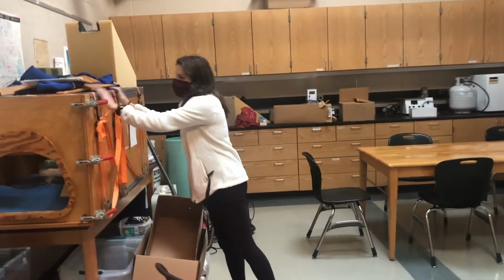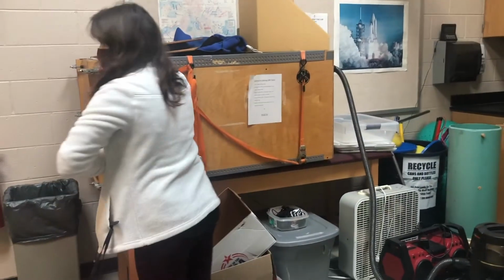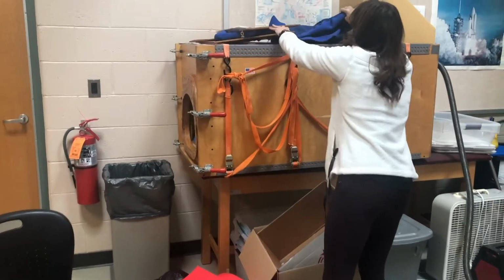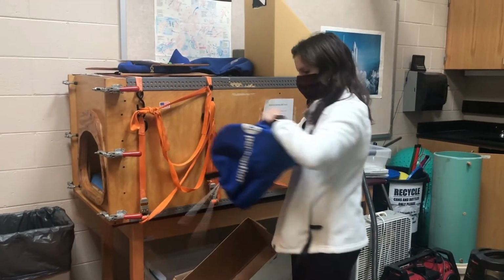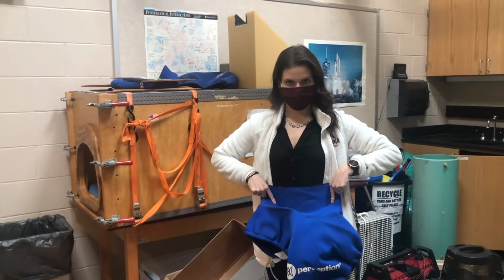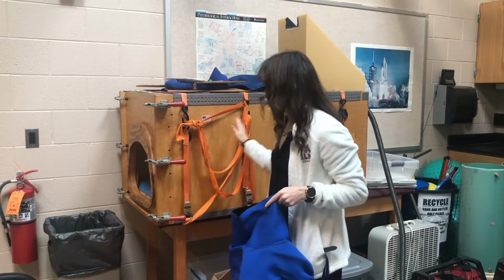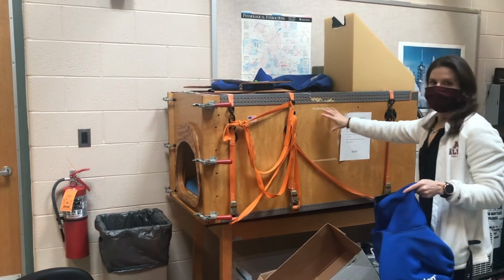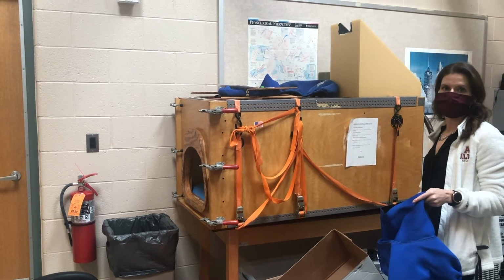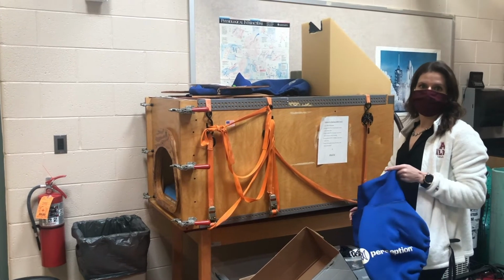And then this last piece of equipment in the cardiovascular lab is what we call the lower body negative pressure box. We can have someone actually get in here to where their torso from kind of mid-torso down is in the box. And then we can put them in a nice kayak skirt. So I can put this around my waist. We hook it up to this box so their upper body is sticking out. And then we actually use a vacuum to create negative pressure in the box, which pulls the blood down towards your lower limbs. And we can look at how your heart responds to try to maintain blood pressure at a normal number.